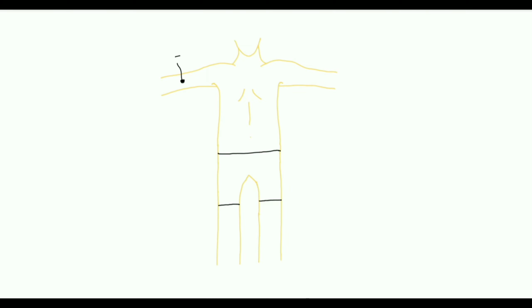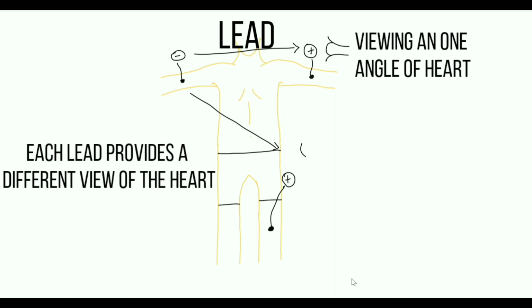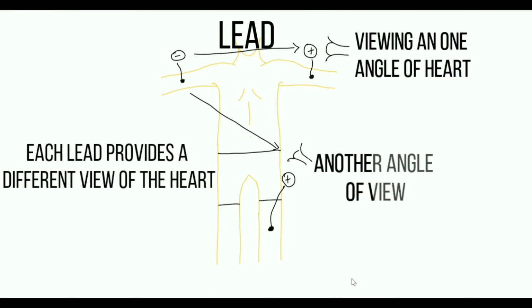A pair of electrodes consisting of positive and negative electrodes constitutes an electrocardiographic lead. Each of these leads is oriented to record electrical forces as viewed from one aspect of the heart. So, the position of these electrodes can be changed so that different leads are obtained. The angle of electrical activity recorded changes with each lead. Several angles of recording provide a detailed perspective of the heart.